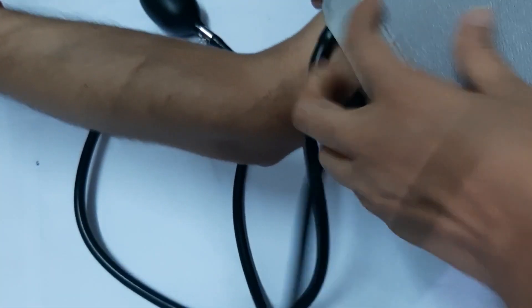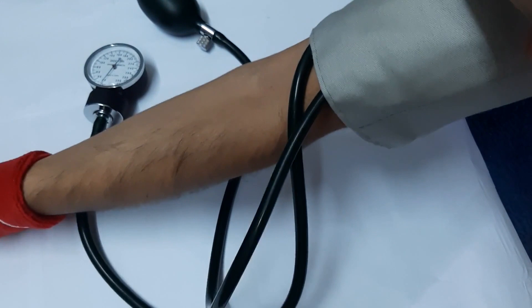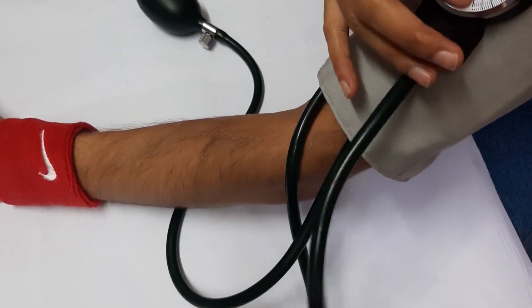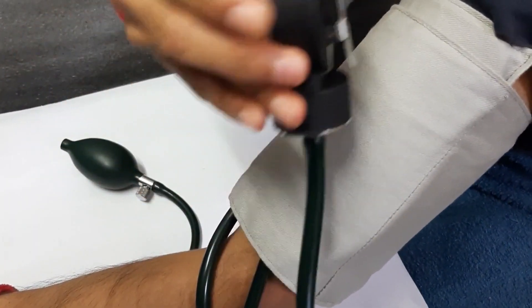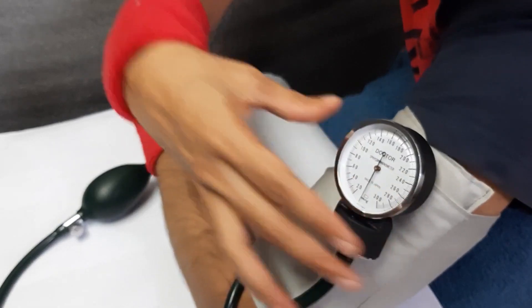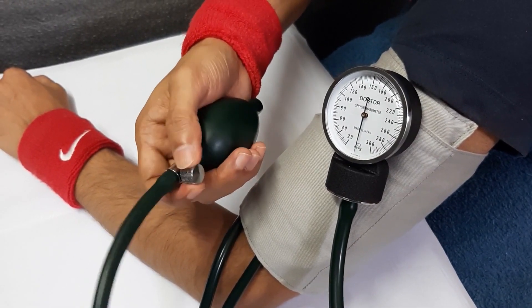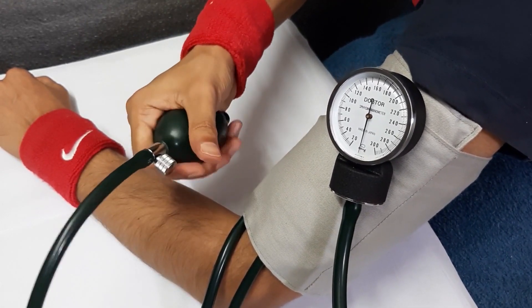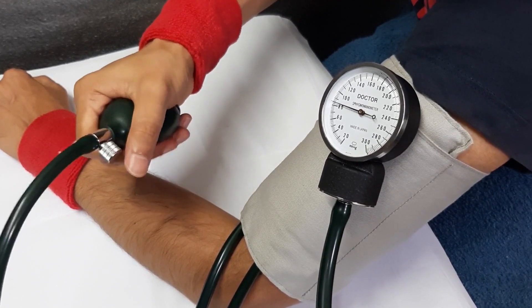You can wrap the velcro cuff around the patient's arm. Make sure the pressure control valve is tight. Then squeeze the pump and continuously pump it up to just about 200 mmHg.